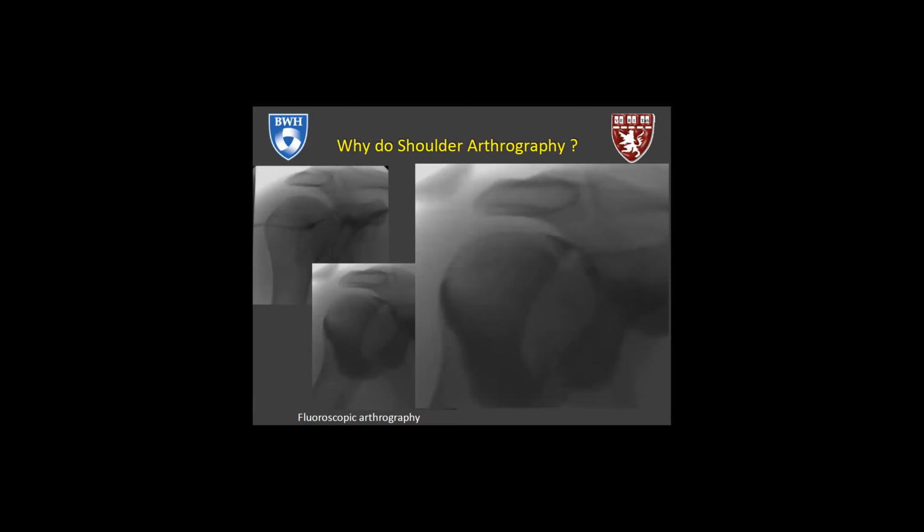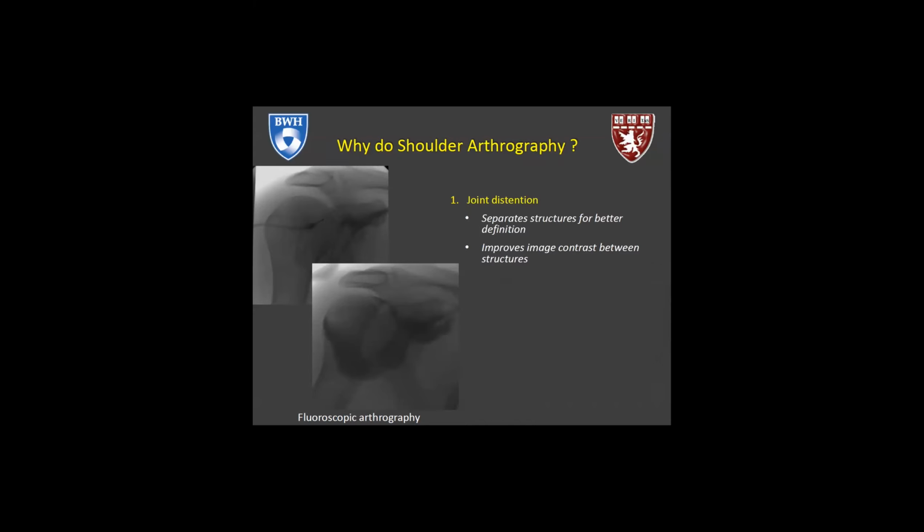In the magnified view, after we take the needle out, you can see that there's contrast, only a small sliver of that dark contrast outlining the glenohumeral joint, and then underneath that, opposing that, is the cortex of the humerus. And in between, you see that lucency here, and this goes to show you how nicely we can opacify and see the humeral head cartilage. And we would not have been able to see that without that contrast in the joint. And so there's a lot of beauty with introducing contrast in the joint and really resolving the soft tissues there.